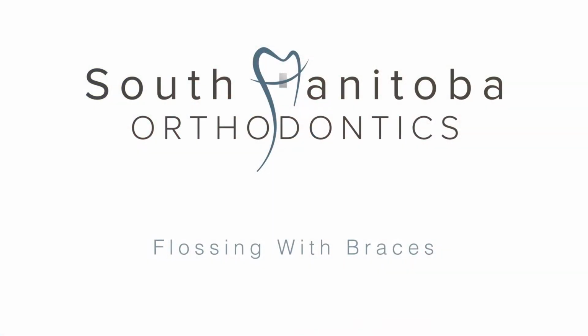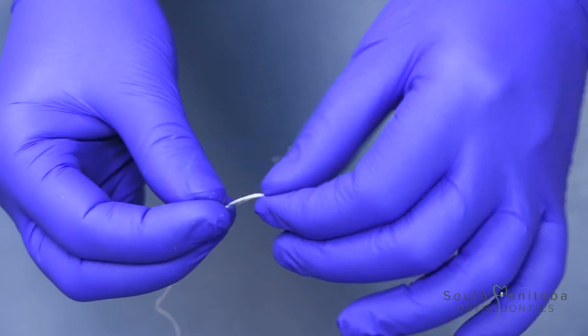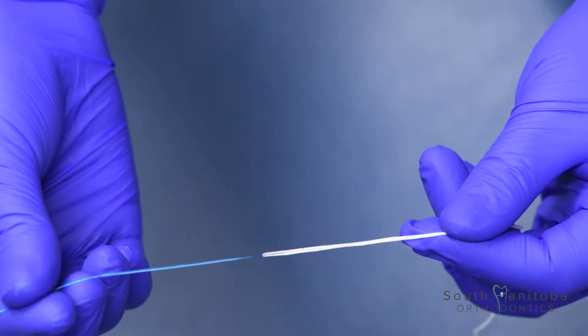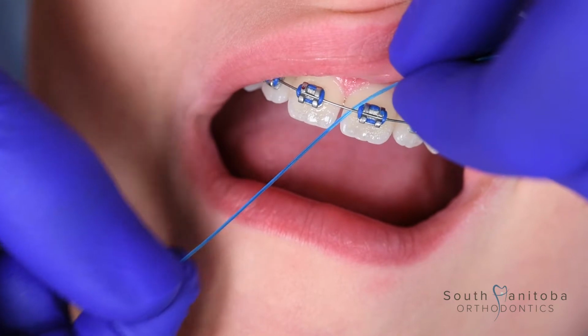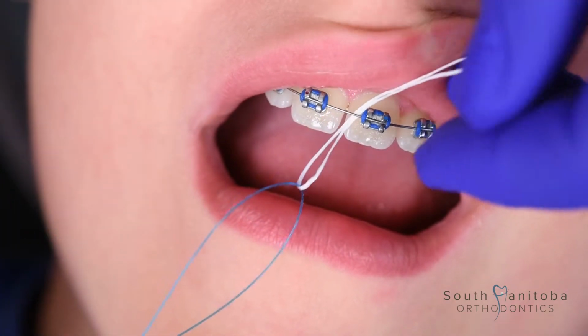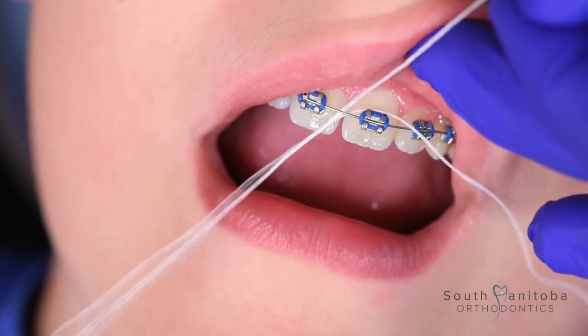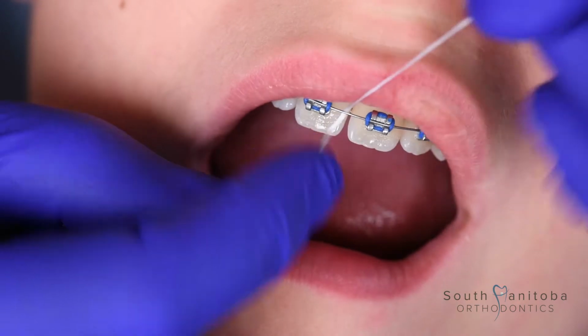Okay, let's go over how to floss with your braces. You're actually going to need to thread the floss under the arch wire. So to help you do that, you can use what's called a floss threader. Start with about 18 inches of floss and pull 3 to 5 inches of the floss through the loop at the end of the threader. Now, thread the floss threader under the arch wire and gently go between your teeth, hugging the sides of each tooth. Then just remove the floss and keep going around in between every tooth.